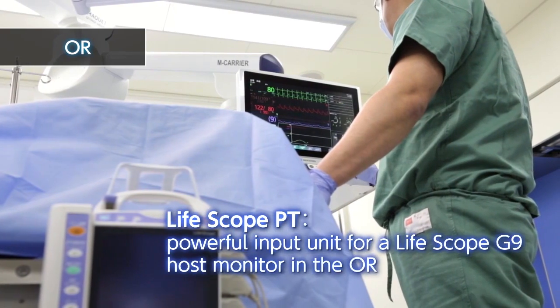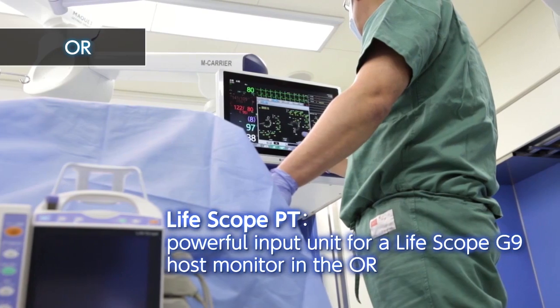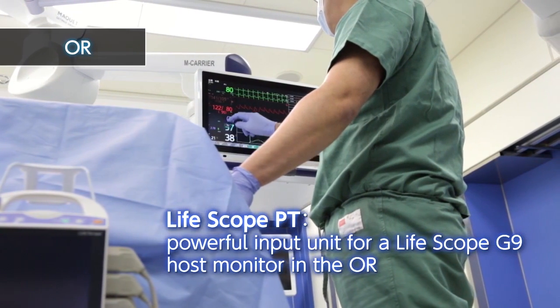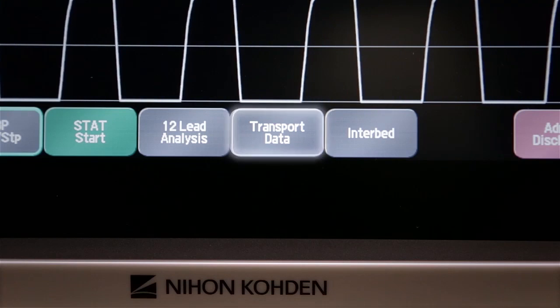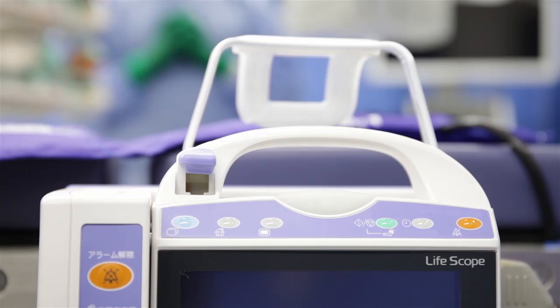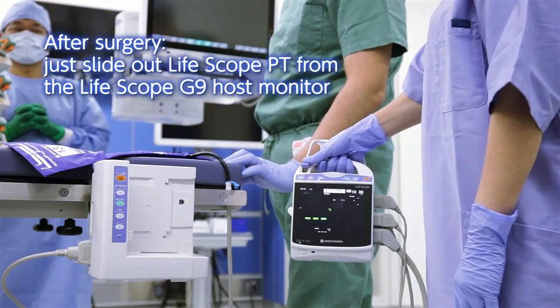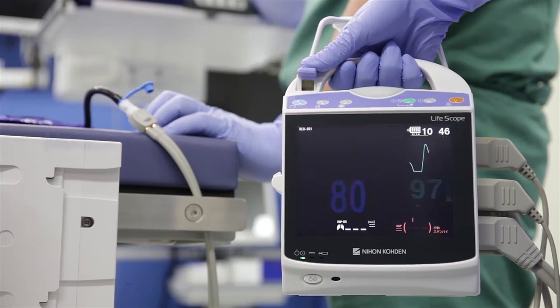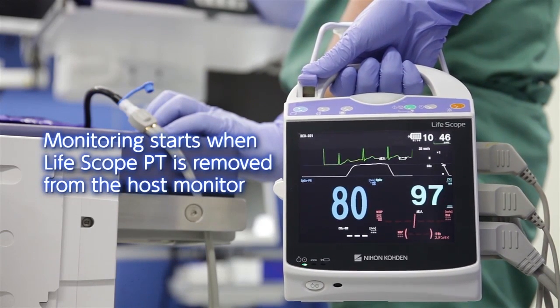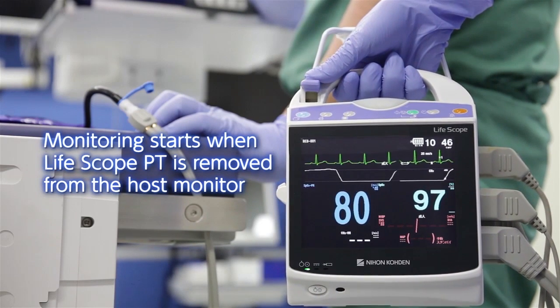LifeScope PT can monitor many parameters and serve as an effective input unit for a LifeScope G9 surgical monitor. When transporting the patient to the ICU after surgery, just slide the LifeScope PT out of the LifeScope G9 bedside monitor in the operating room. When the LifeScope PT is removed, it starts monitoring the patient as a transport monitor.